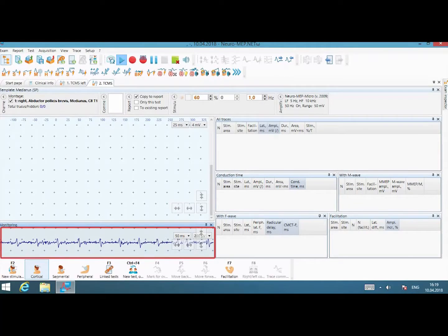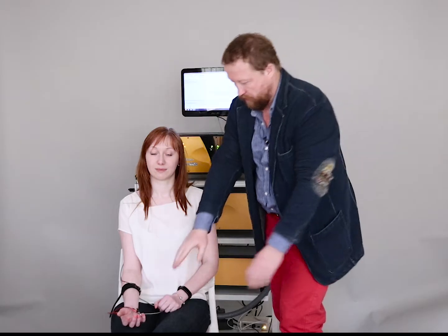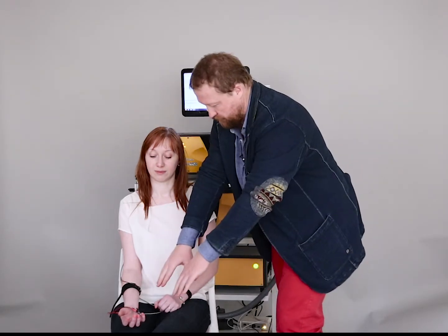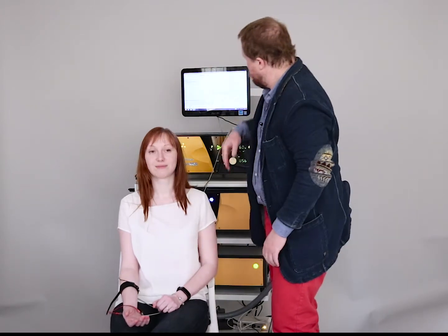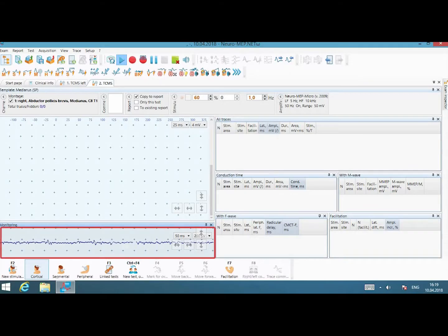First, I will show EMG. This is the EMG — this is what we pick from the muscle. Relax, please. Fully relaxed. This is the EMG, the baseline.